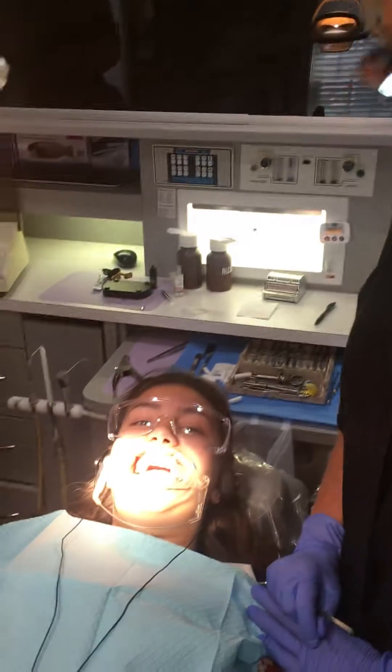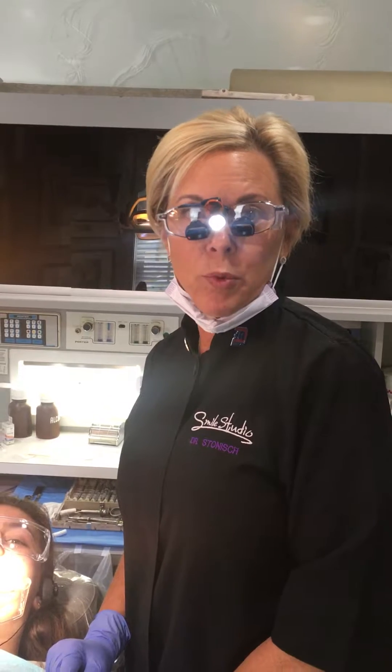Hi, I'm Dr. Stonish. I'm here today placing sealants on one of our kind patient's teeth. Did you know that 40% of children going to kindergarten in the US have decay? It's of epidemic proportion and we have a technique whereby we can seal the teeth to try to mitigate that decay process.